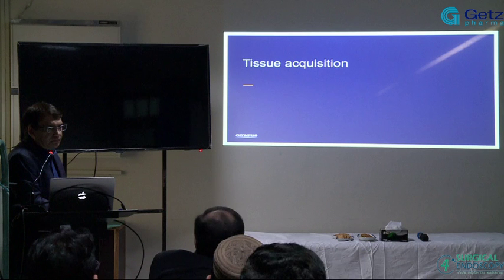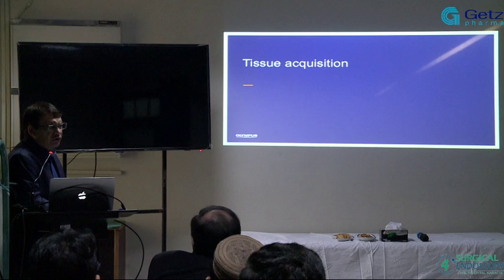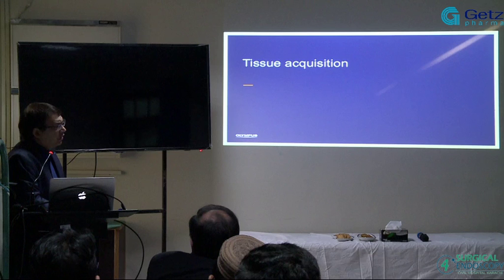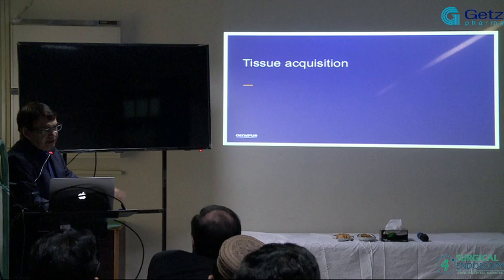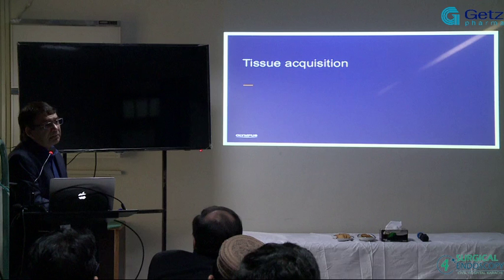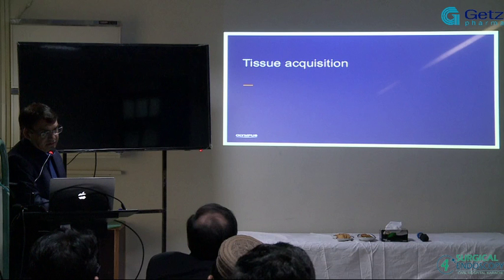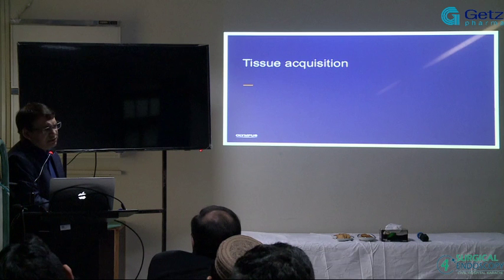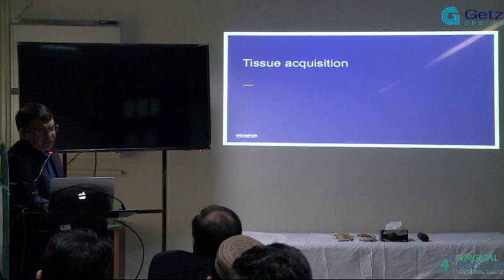So you like to do the linear for the mediastinal nodes. Yeah. You can't do anything with the radial, right? Even for the mediastinum, you can't do the biopsy without the FNA. Radial is never for FNA. You don't see the needle; you see it as a pinpoint, because it's just going in front of it and it's not in the plane of EUS imaging. So any time a needle has to go in, it's going to be linear. No, you cannot do that with a radial. If you've got to do a biopsy, it has a working channel, and you can put a biopsy forceps through that. I usually use a pediatric biopsy forceps if I have to do a regular biopsy, but needle, no.